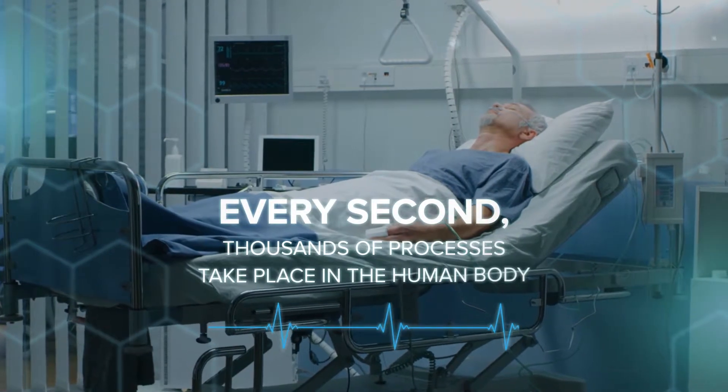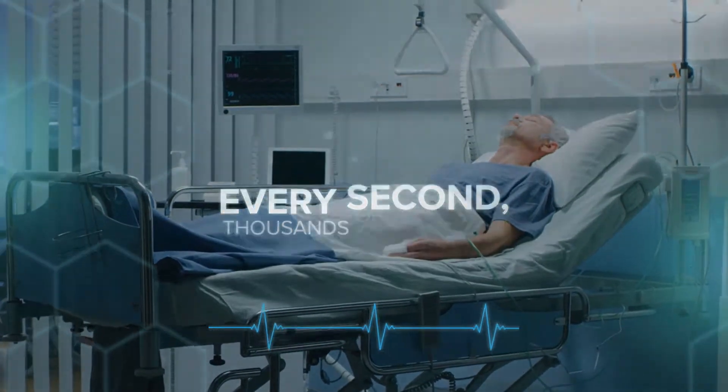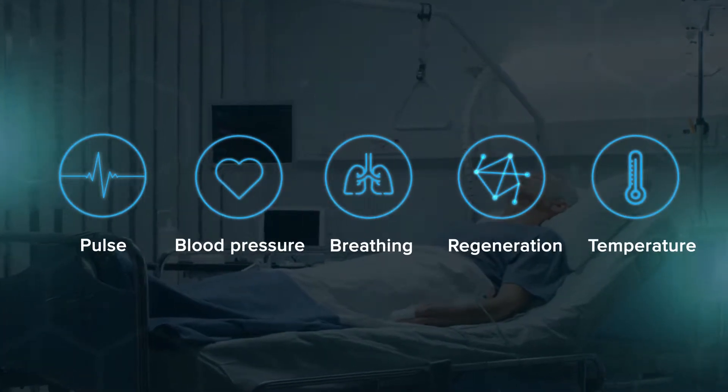Every second, thousands of processes take place in the human body. A sensor thinner than a human nerve is enough to monitor vital functions.